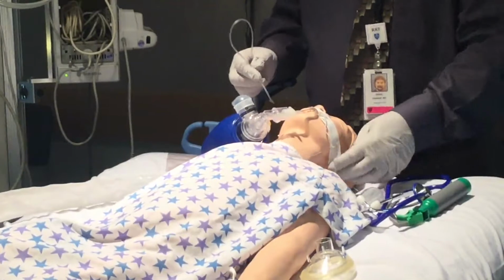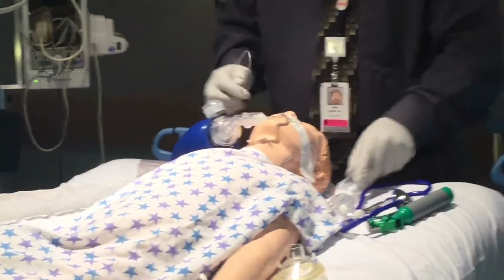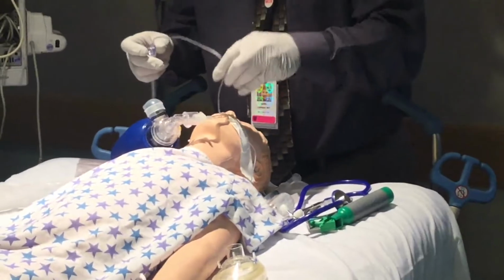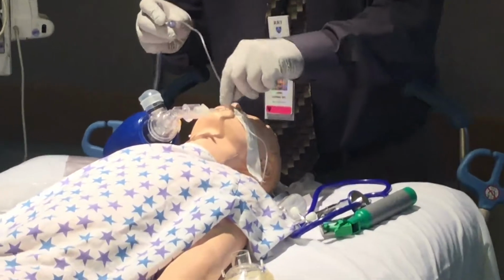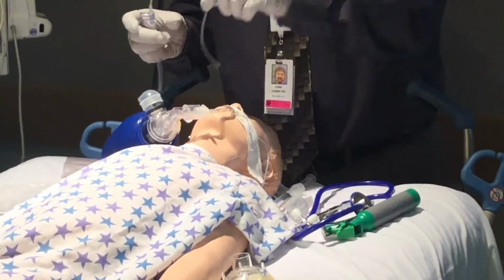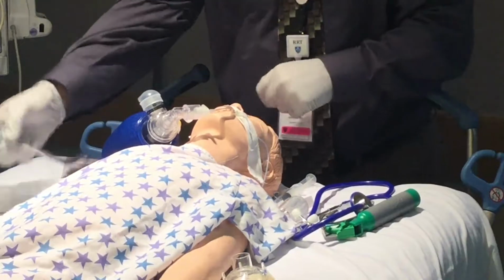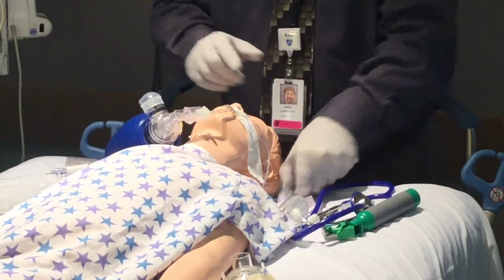Extubating with a cuffed endotracheal tube. 1. Always suction pooled secretions above the cuff. This reduces the incidence of aspiration and ventilator-associated pneumonia. 2. Take down the cuff by removing the air from the cuff.